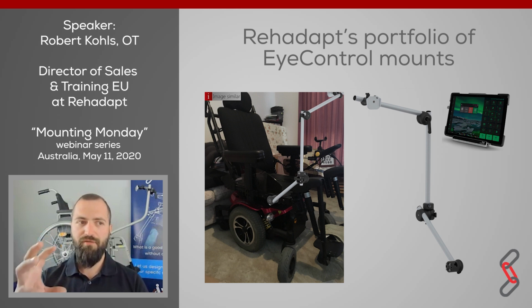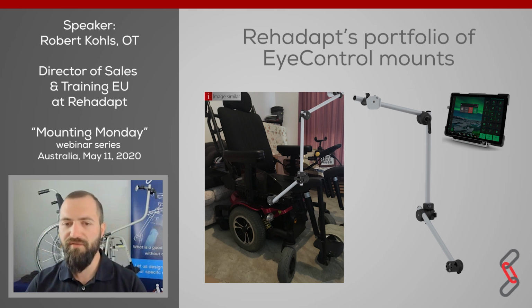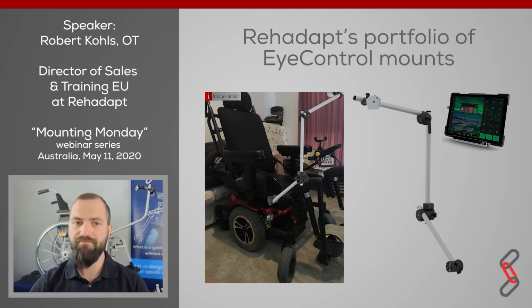We would attach the frame clamp to the right side of the wheelchair, with one tube that allows us to bring the swivel unit into the right angle, that will not obstruct the footrests. Then the vertical tube would bring the communication system to the right height for the device, and then the horizontal tube gives the right angle to adjust the screen to a good high position in front of the customer's face.